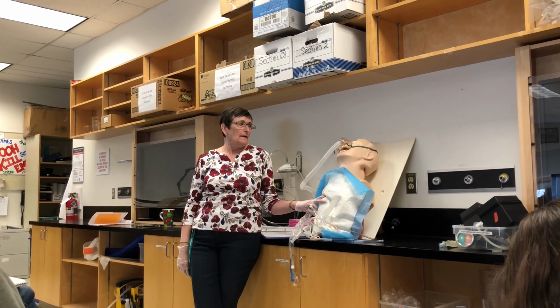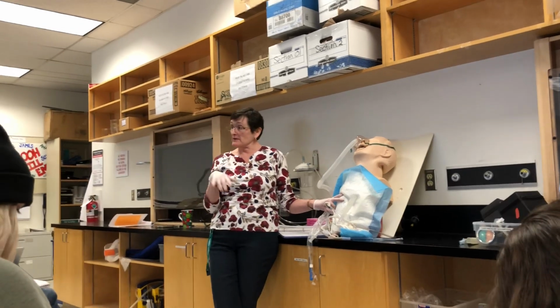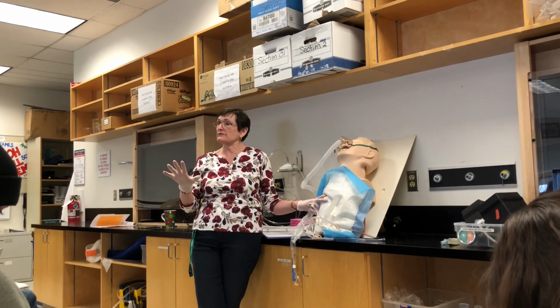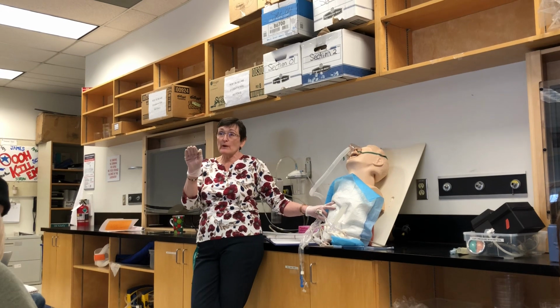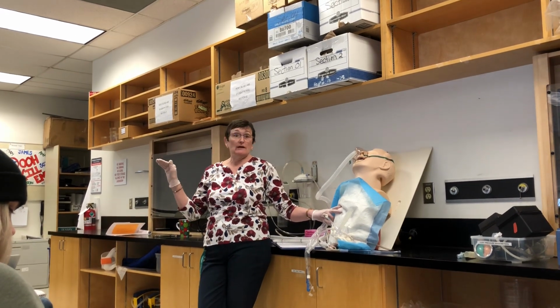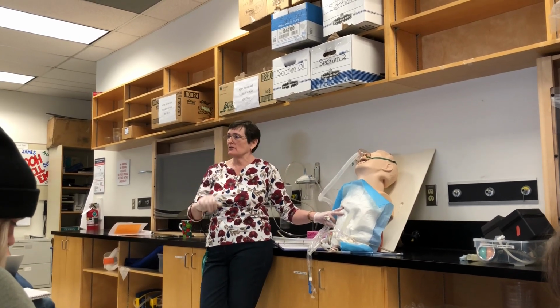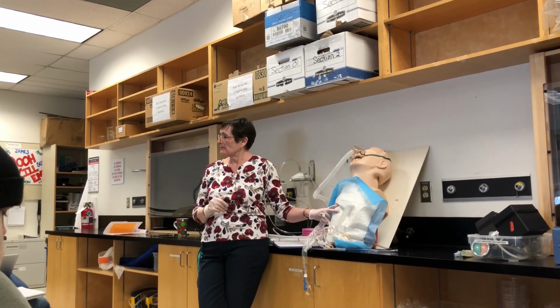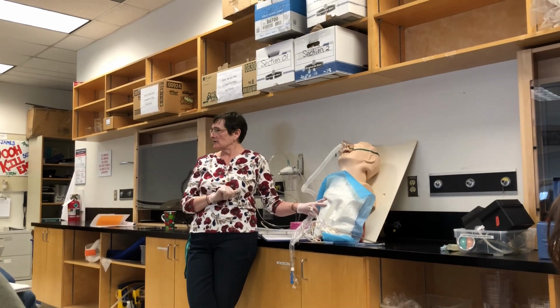We may also have to increase his FiO2 depending on what's happening with the saturations. So we're trying to maintain adequate saturations. This is why it's really important to look at where their saturations have been before you extubate, and make sure that you bring their sats back up to where they should be post-extubation as well. So really watch everything. You're watching the cardiovascular status, you're watching the work of breathing. We don't go very far once we've extubated a patient.